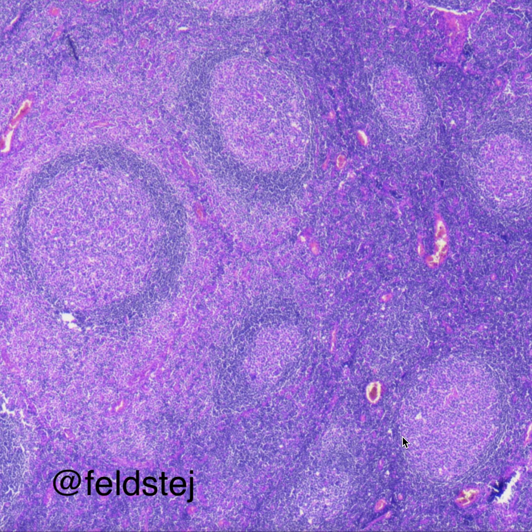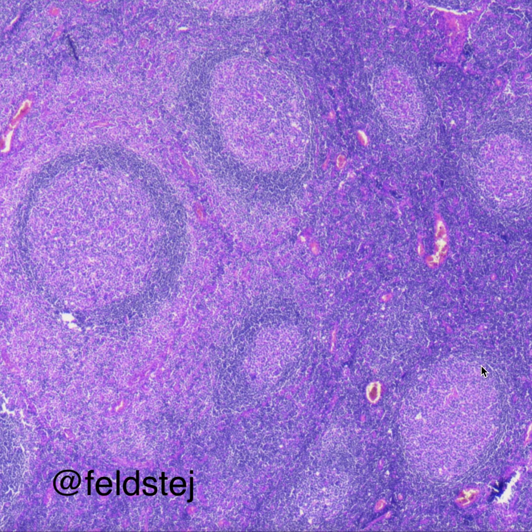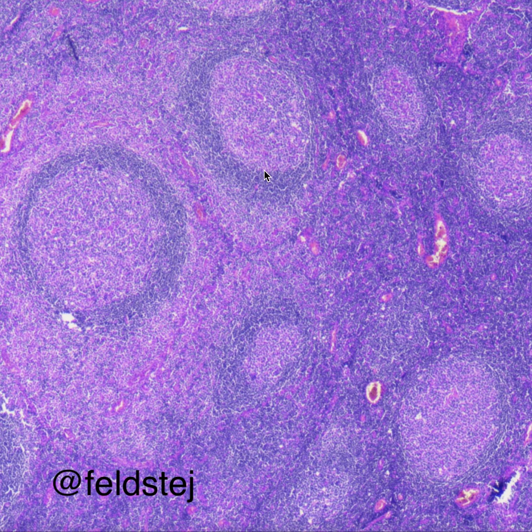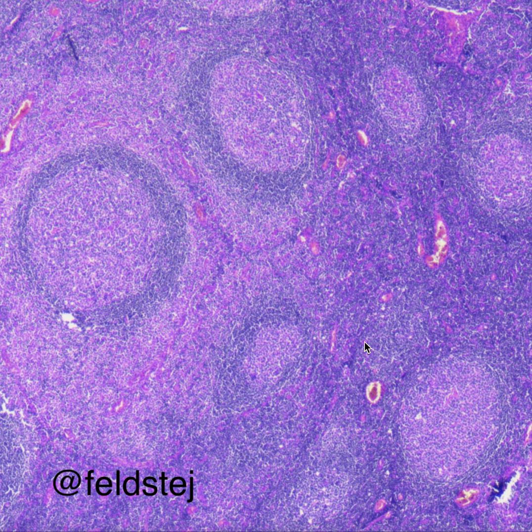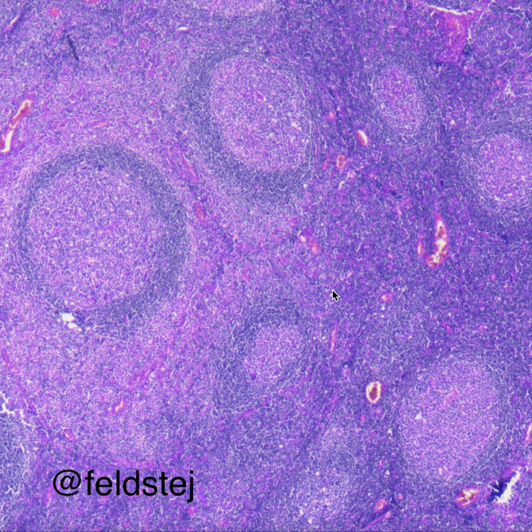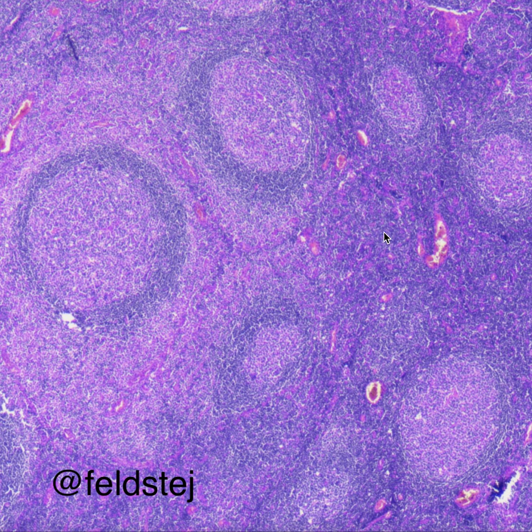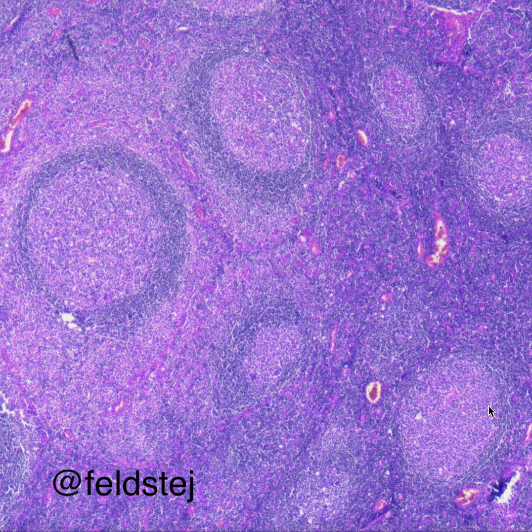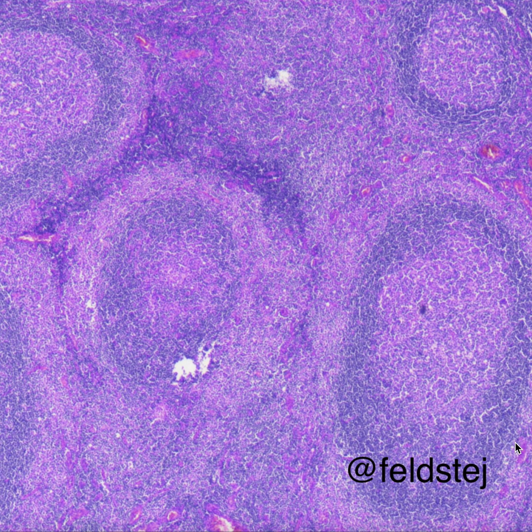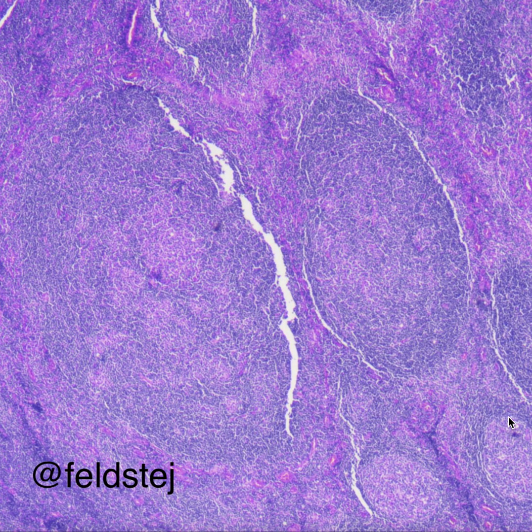Other differential diagnoses include mantle cell lymphoma, but we see retained mantle zones and not expanded mantle zones. Marginal zone — nodal marginal zone lymphoma — where you see more of an expanded interfollicular paracortical expansion. We do not see that here as well. So these are examples of florid lymphoid hyperplasia.